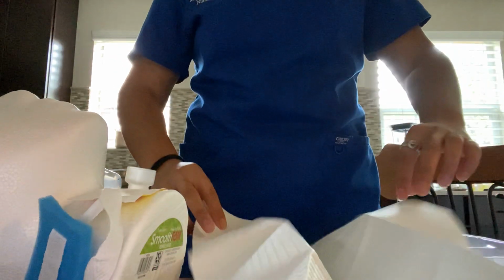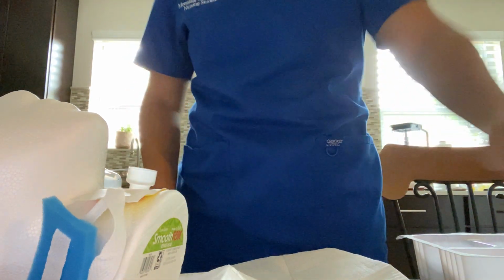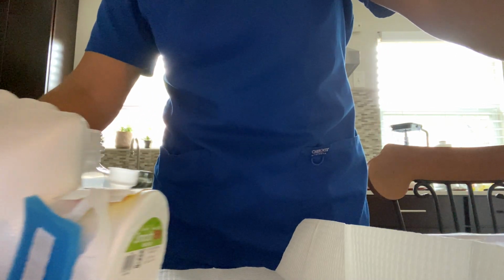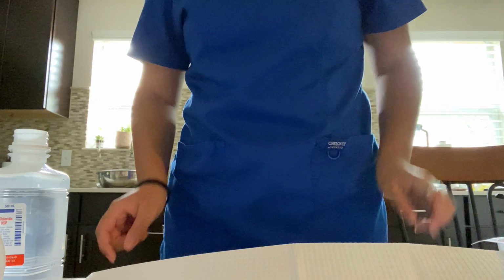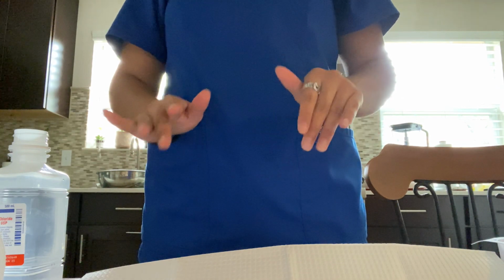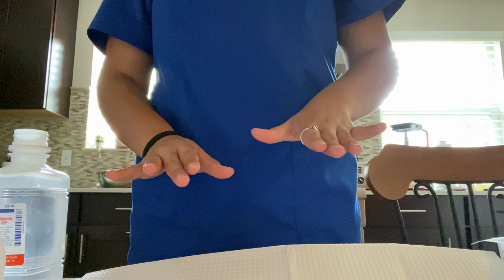Okay, shiny side down, maintaining sterile technique. I'm not going to touch all of it. I'm just going to lay it down, only touching the tips. This is my sterile field. Okay, everything's sterile. I didn't break it. We're good. And then that will be my sterile field.